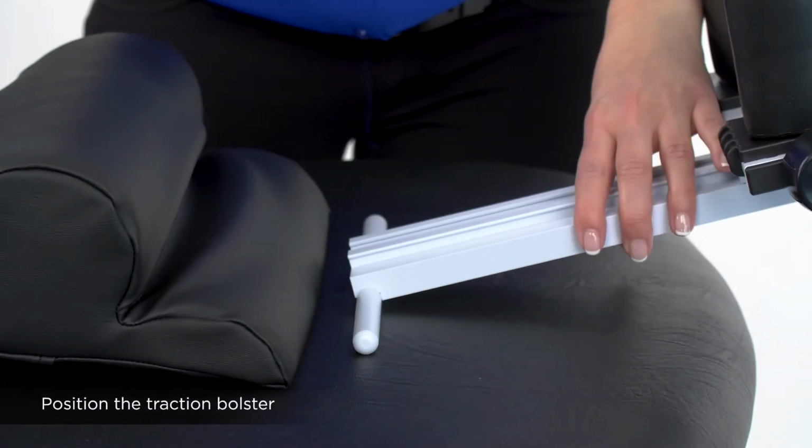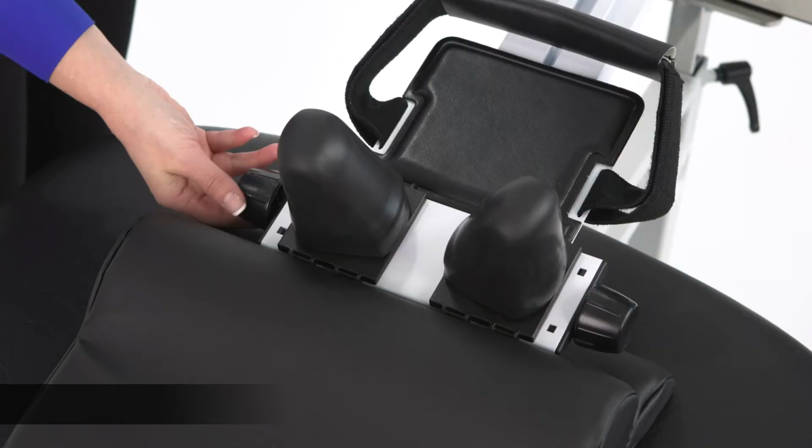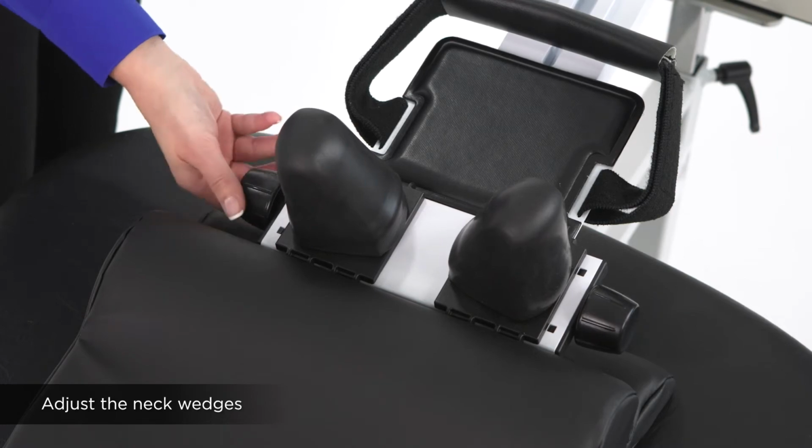Place the base of the Saunders clinical traction device on the base of the traction bolster. Increase the width between the neck wedges to allow ample room to accommodate the patient's neck.